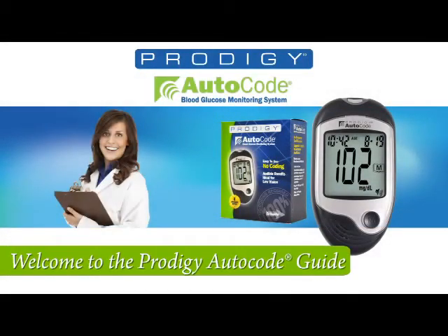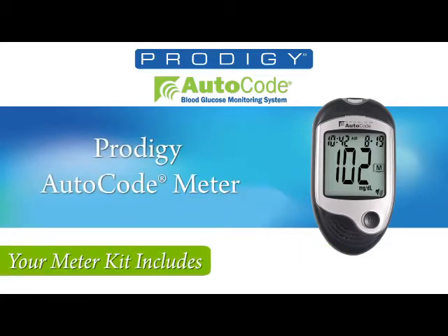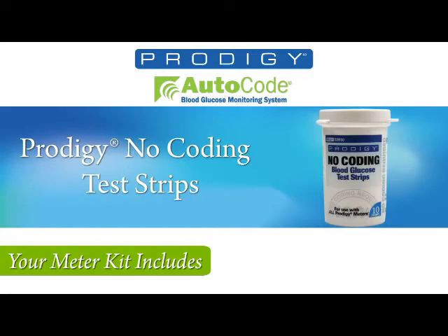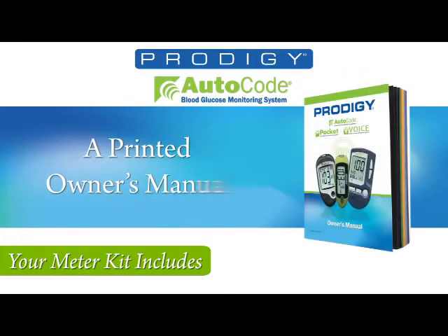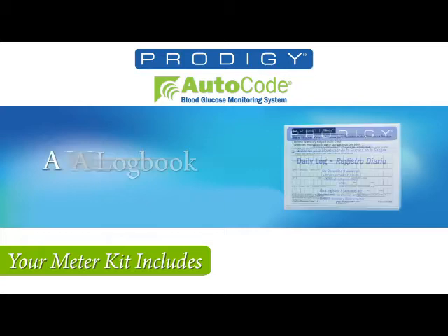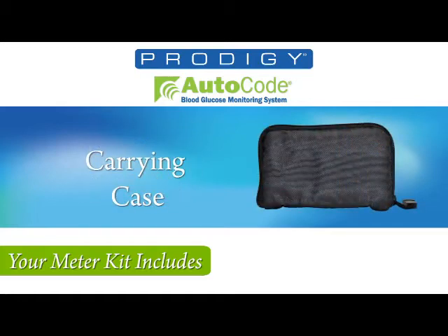Welcome to the Prodigy AutoCode Meter. Upon opening the box, you'll find inside the Prodigy AutoCode Meter, Prodigy No-Coding Test Strips, Prodigy Control Solution, a Lancing Device, Lancets, Printed Owner's Manual, Logbook, Warranty Card, 2 AAA Alkaline Batteries, and a Carrying Case.